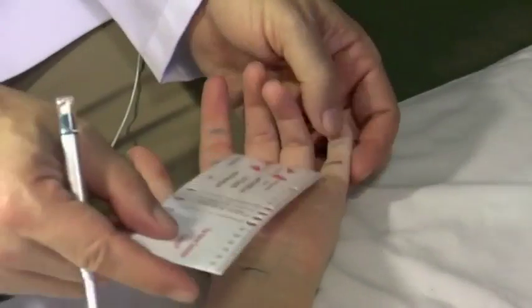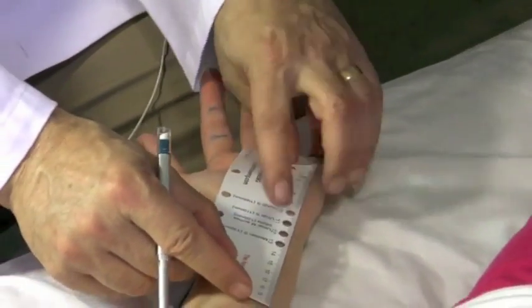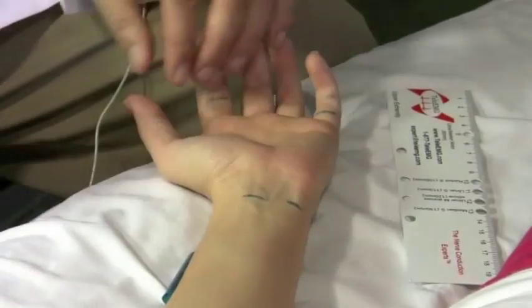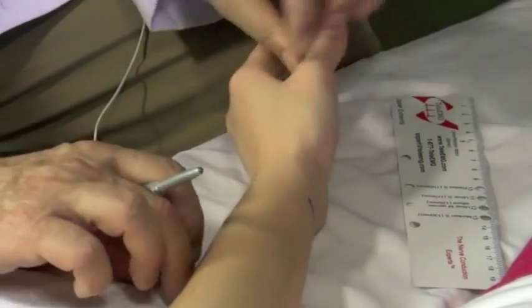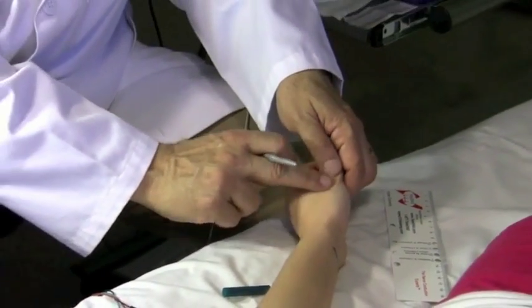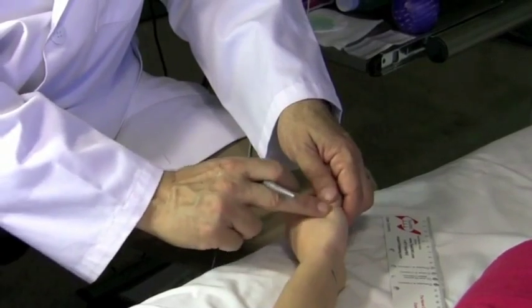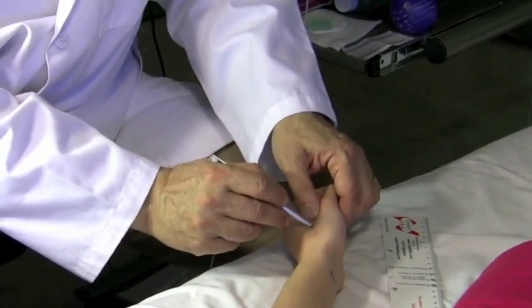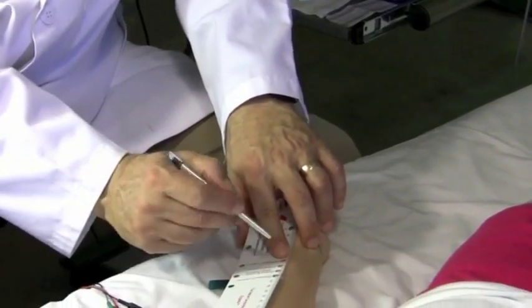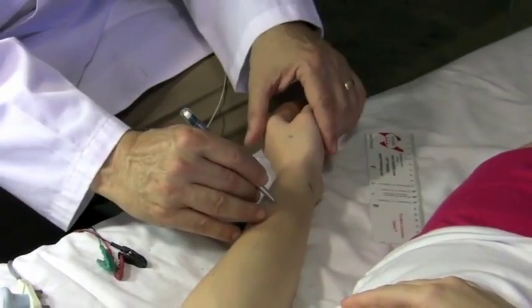And that's where I'm going to stimulate the median nerve. For the ulnar nerve, it's going to be 11. The ulnar nerve is on the side of the wrist. Mark up the spot. That's what I'm going to stimulate for the ulnar nerve. Now the radial nerve is really at the bottom of this V between the index finger and the thumb. So I mark up the place where I'm going to record from. And it's 10 centimeters above, right over the bone.